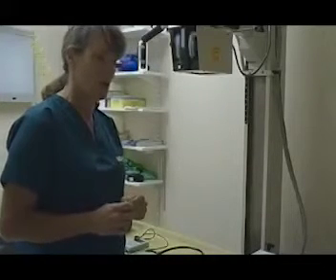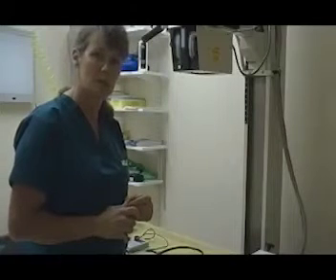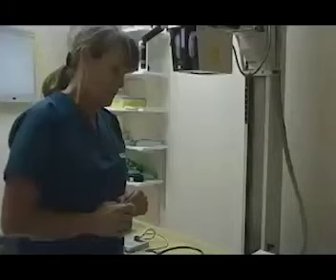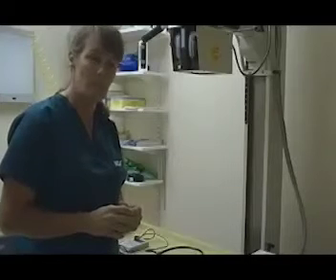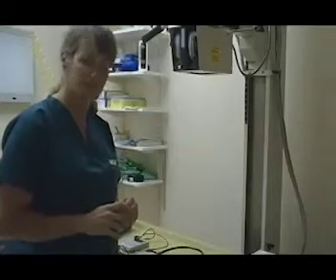Any changes or nearing the lower limits or upper limits of any of those vitals should be immediately brought to the attention of the veterinarian in charge. Also, all these vital signs should be monitored manually to assure accuracy of the monitoring equipment.